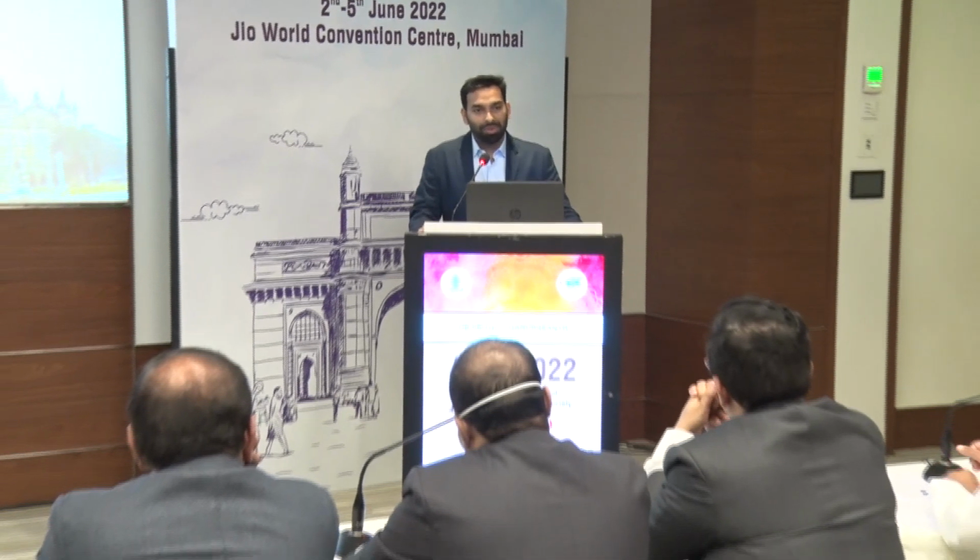So one question. Parallel to each other? Yeah, it would be better. Yeah, it is better to be parallel, because then we always get a little bit of aberrations. So there is a lot of aberrations when we use 4 lenses together. But if we make it like how we have made it in one, this total magnification in one lens, it is giving fewer artifacts. So how do you ensure they are parallel once you've glued them? Yeah, it was just manually.